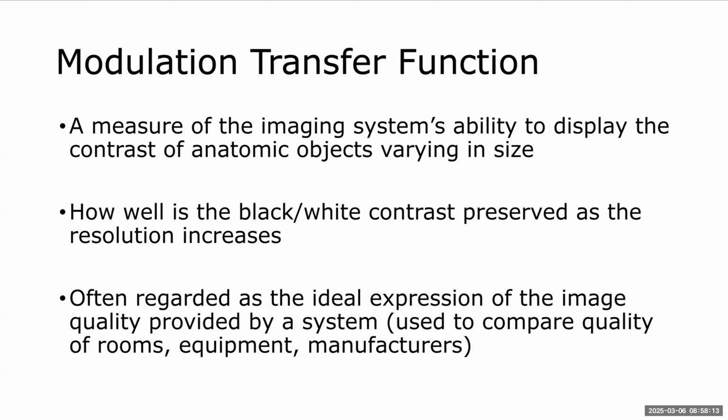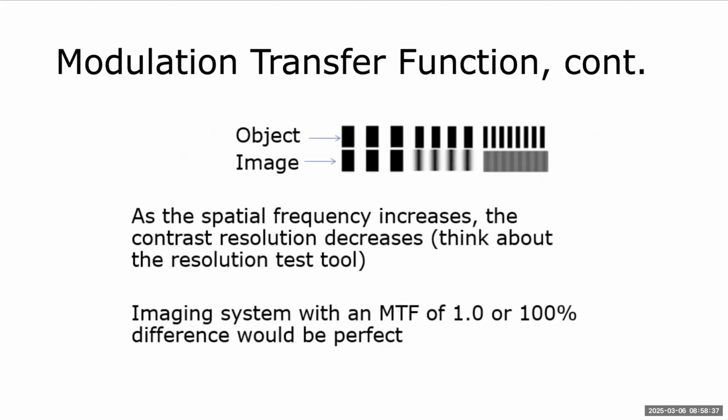The bottom line is the main thing I want you to remember about modulation transfer function is that it's often regarded as the ideal expression of the image quality provided by a system. So if you are responsible or you're part of a team that is purchasing equipment, then this is something that you would look at. What is the modulation transfer function of the equipment?